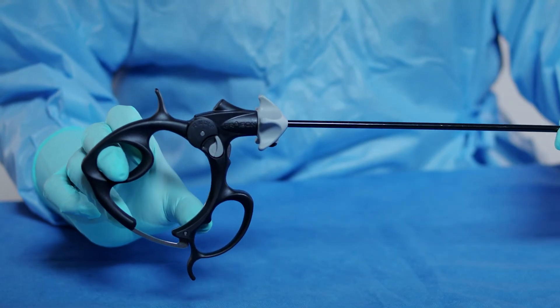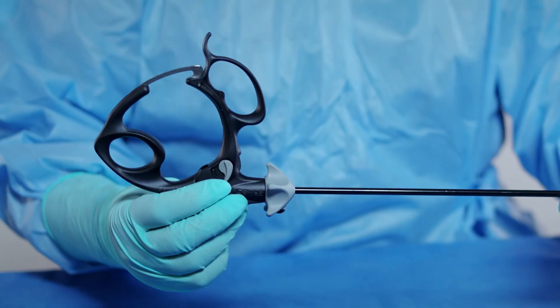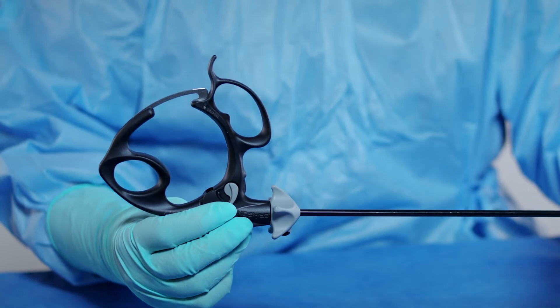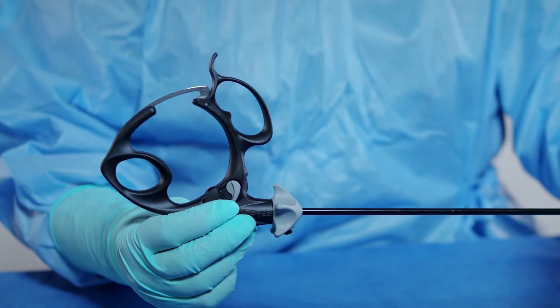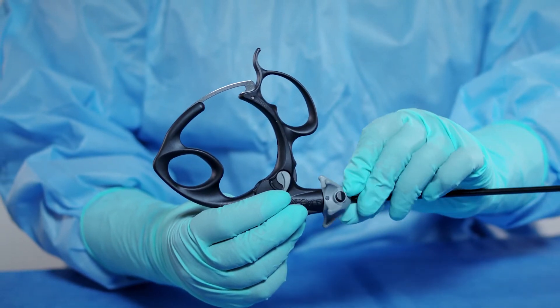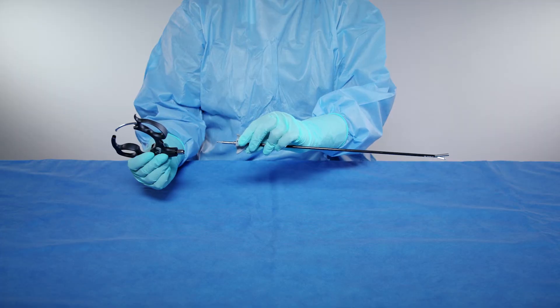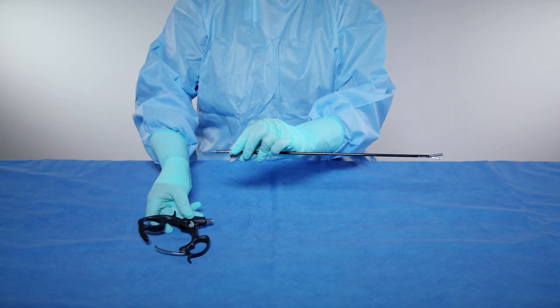Grasp the handle with your thumb and index finger and turn the handle up. Then press the black button on the gray rotation knob and separate the sheath tube from the handle. Ensure that your hands do not restrict the handle from opening as you separate the sheath tube from the handle. Place the handle aside.